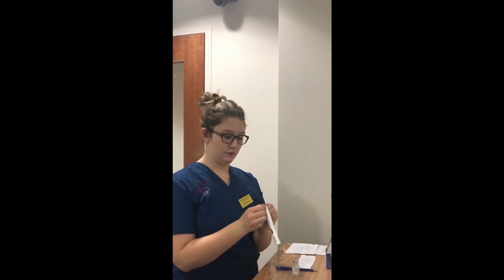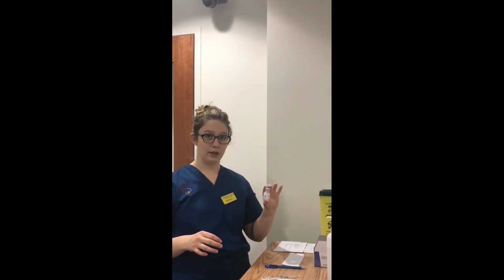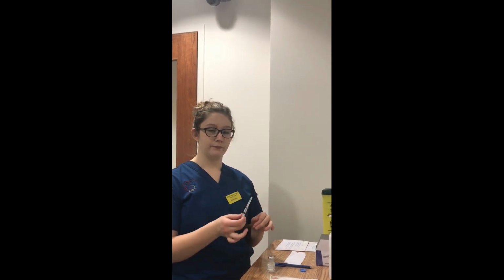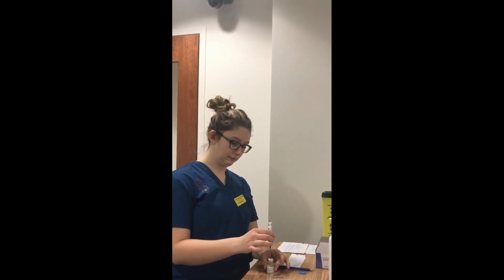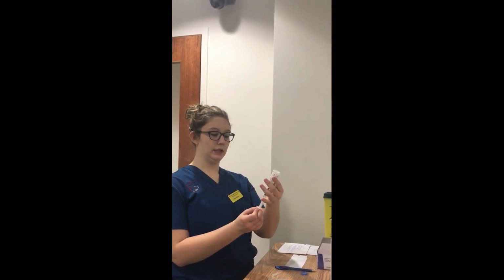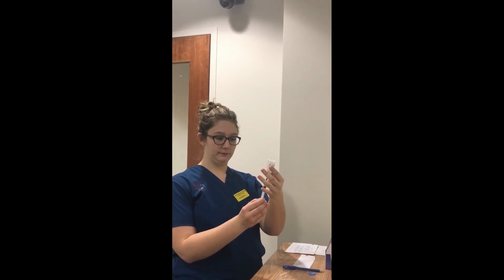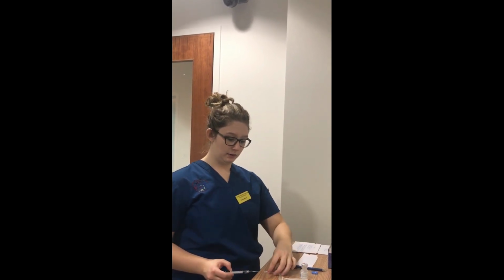We'll remove the syringe from the plastic. This is a new vial of Haldol, so I will take off the top. If it was not brand new, then I would sterilize the top with an alcohol swab before inserting my needle. And I will draw up to a little bit past the 0.5 ml line, just in case I have air bubbles, so then I can remove them. Okay, and then I will put on the plastic sheath.